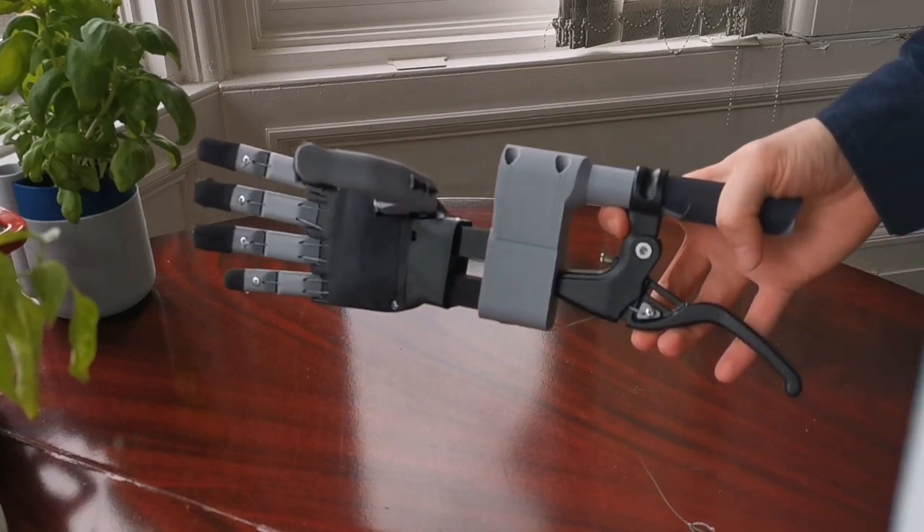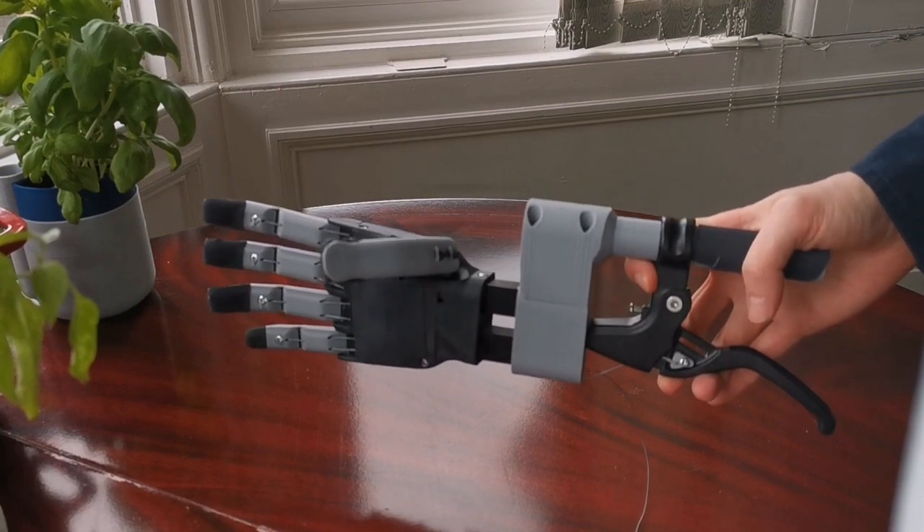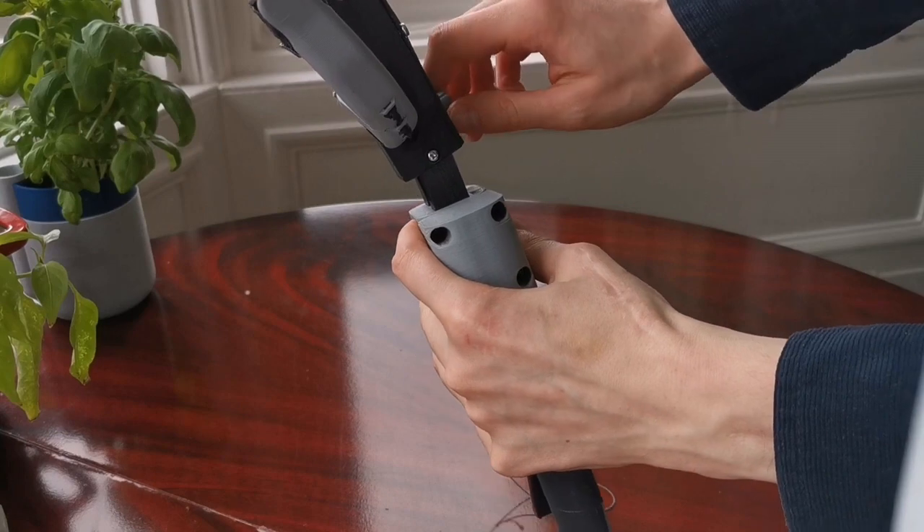Just like last time, you can rotate the thumb to switch grip positions, although there are a couple of new features which you may have seen on Instagram sneak peeks — which, if you aren't already, get following.